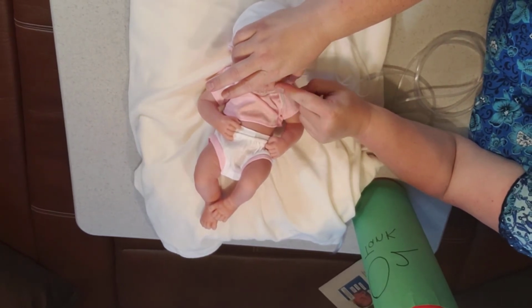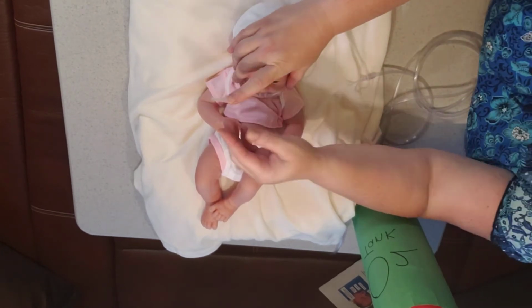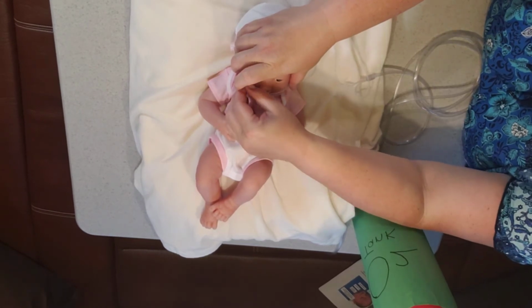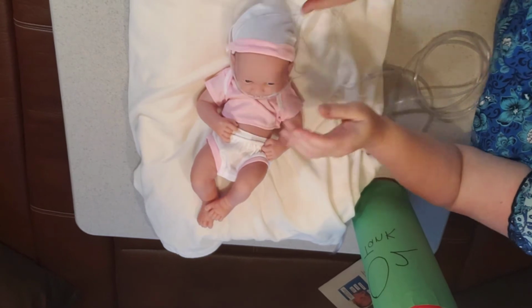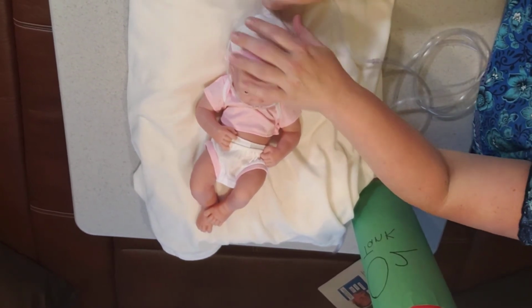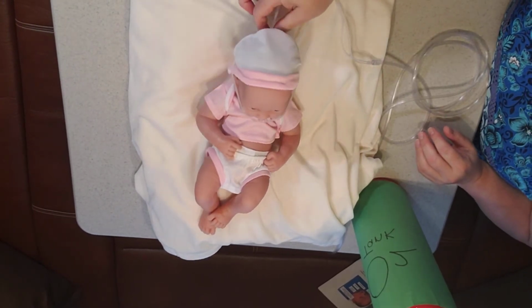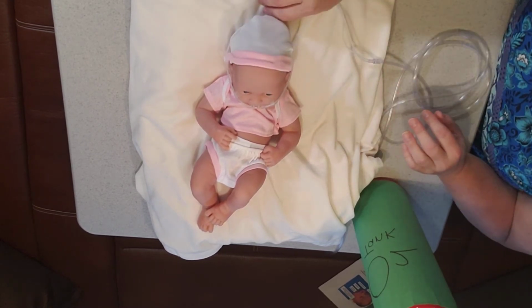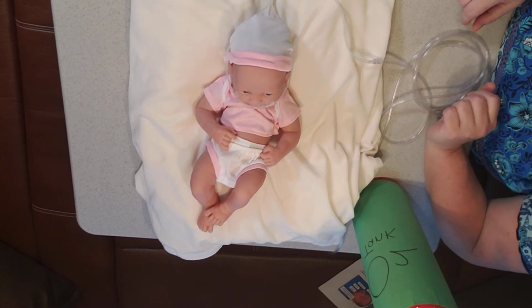So I'm using sensitive tape here, or tape for sensitive skin. You can get that at any medical supply or pharmacy, and you just hold it in place as you're taping it, and then you can adjust it in the back for her comfort. You don't want it to be too tight so that it's touching her skin, because that can cause breakdown as well. But you don't want it to be too loose so that she can grab it and pull it off. I've seen it happen.